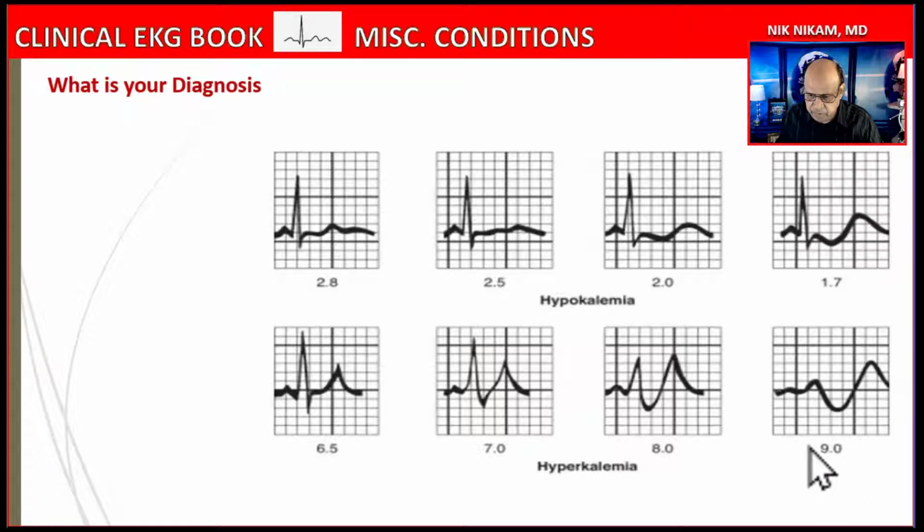So always remember, they may ask you questions based on serum levels of 7, 8, or 9, and have you guess based on the surface electrocardiogram what most likely is the level of serum potassium, and that reflects the gravity of the situation as to how quickly we need to bring the potassium level down. We talked about hypokalemia, we talked about hyperkalemia, and these subtle EKG changes.